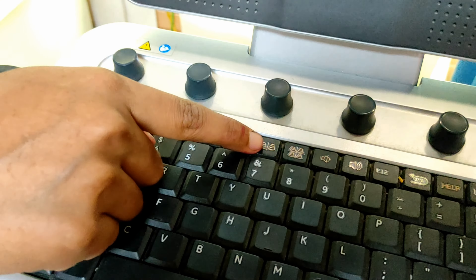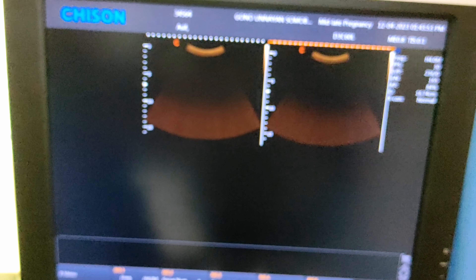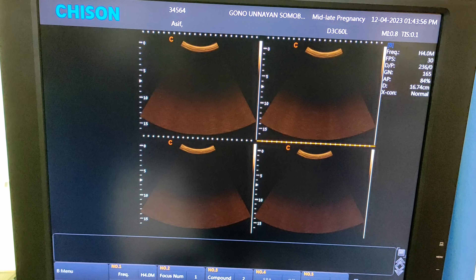This one is the dual view button. Press it two times and it will show you a 2-view or dual view system on your screen. Next to dual view, here is your 4-view button — press it 4 times and it will show you a 4-view system on your screen. This one is the single view button — press it and your screen will show you one single view.